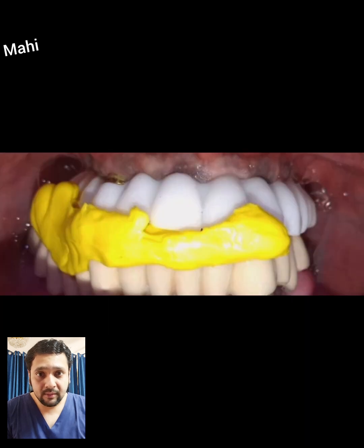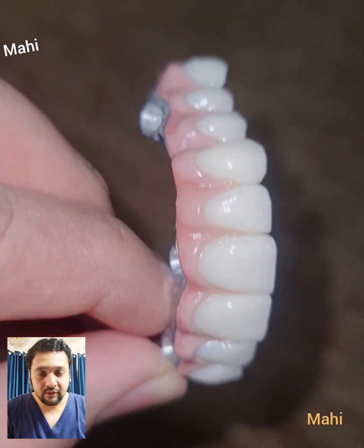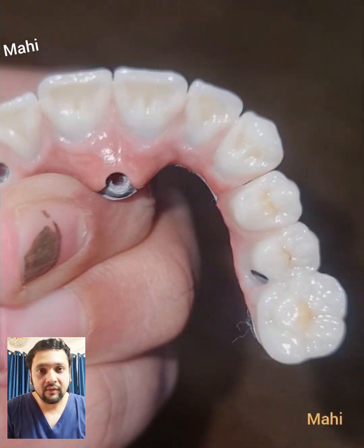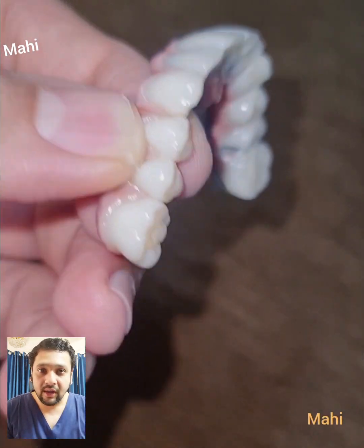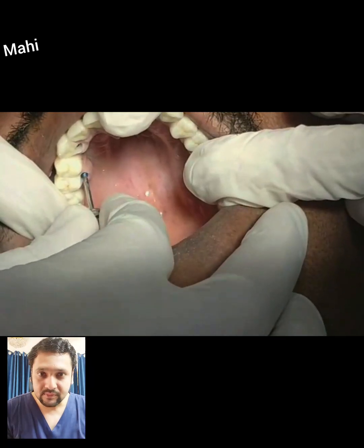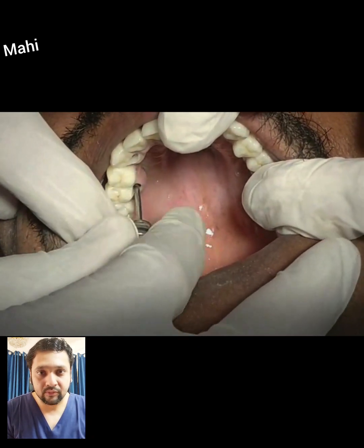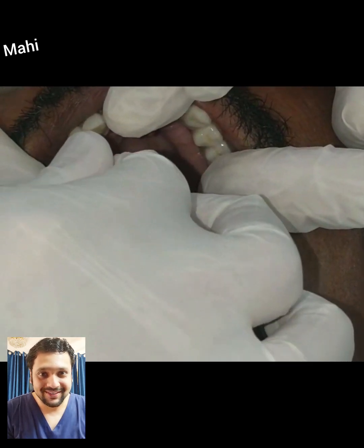So I've done the bisque trial. I've done the occlusal check. I've done the static check, posterior, anterior. I've done the dynamic check, posterior, anterior, and then I've fine-tuned to around 8 to 12 microns all over. And finally, with a shim stock, I've checked it. The occlusion is perfectly fine. I've given a mutually protected occlusal scheme with a shallow protrusive and shallow lateral protrusive group function. Everything is fine. I took a post-op OPG, a few pictures, and the patient is ready to walk out.